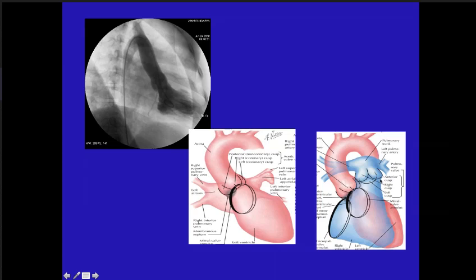Now see this, this is just a diagram to explain this angio. Although I have shown only the LV angio is opacified, you must know where the RV is lying. The RV is lying plumb on top of it like this. So the septum is facing you. That is why this view is not a good view to comment upon for VSD. Because the VSD is present, it will be coming towards you. How can you comment on a VSD which is coming towards you? Because the VSD jet will be hidden in the LV opacified mass. Therefore, this is not a good view for commenting upon VSD.